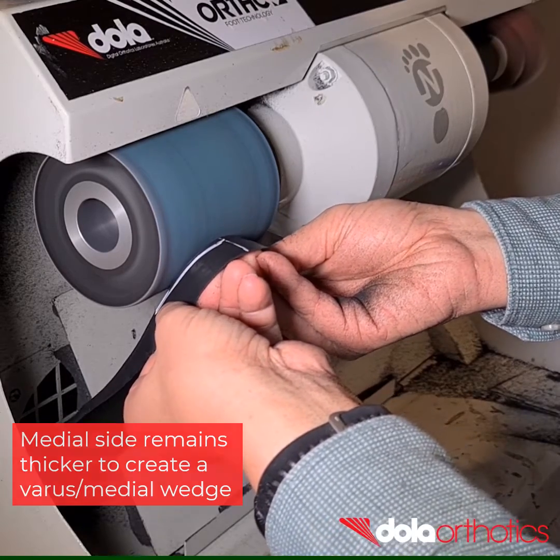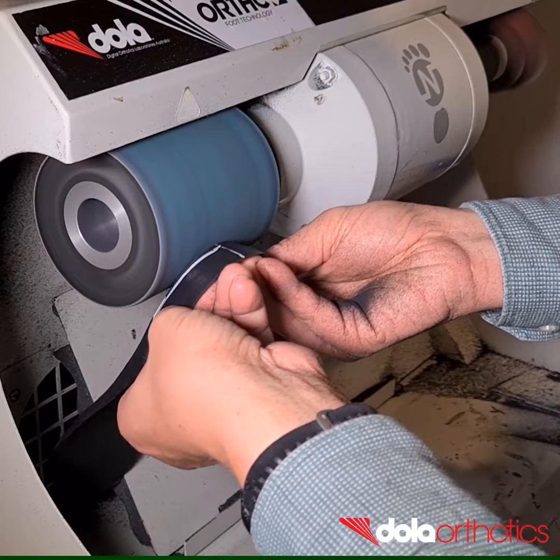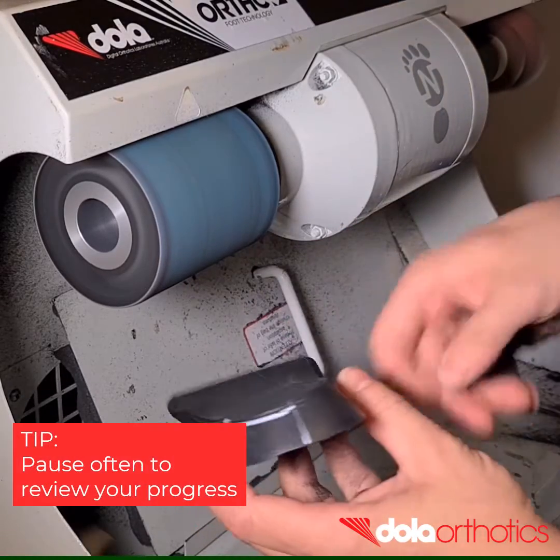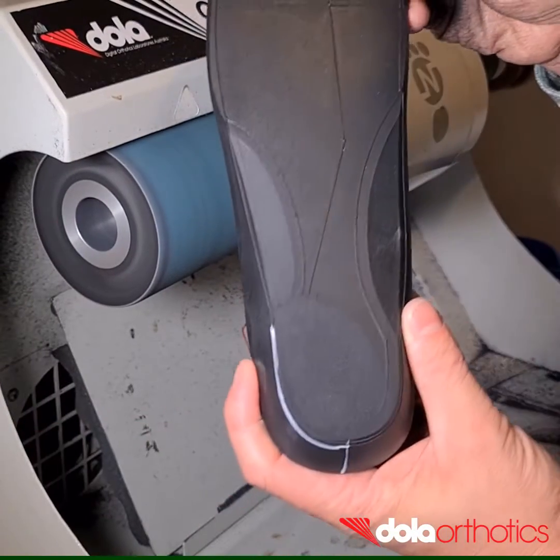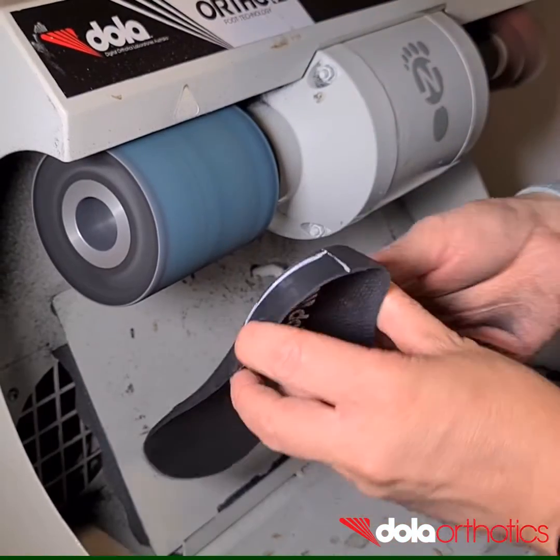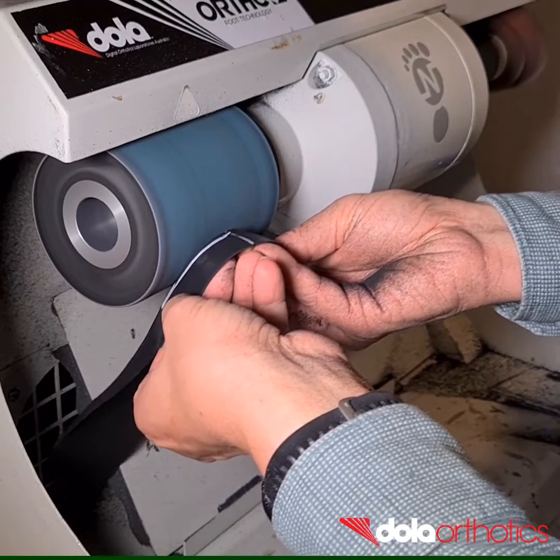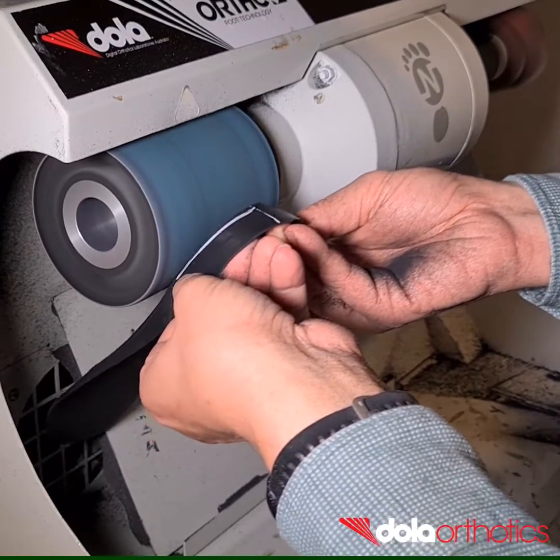Remove small sections of the orthotic at a time until you become comfortable and check your progress against your guideline. The orthotic orientation chosen in this video allows visualization of the guideline. Alternative options include rotating the orthotic, which may also assist in the ergonomics and ease of this modification. Continue to remove material until your grind connects the lateral and medial sides of the Rearfoot post.